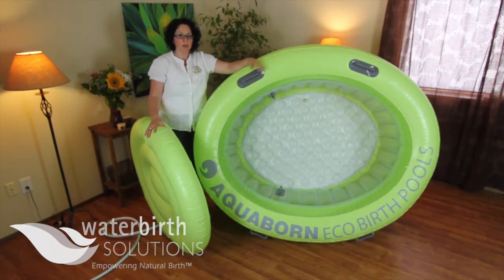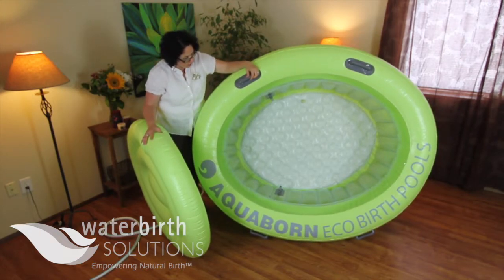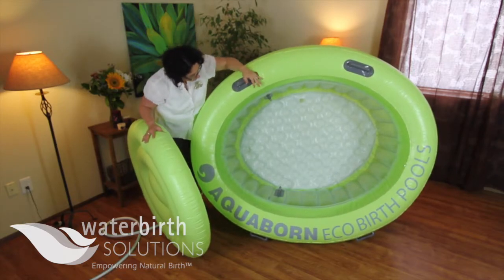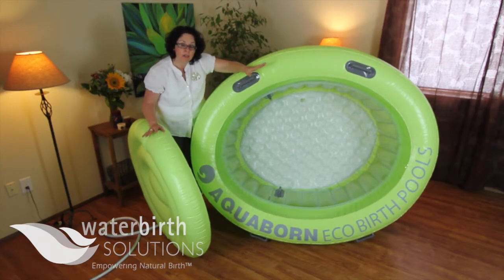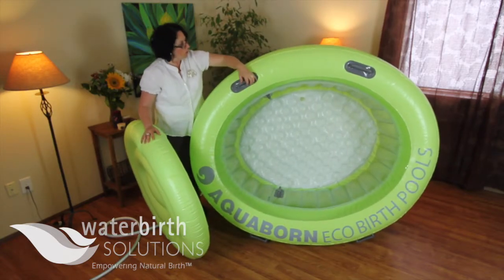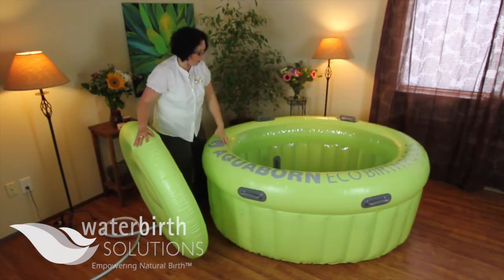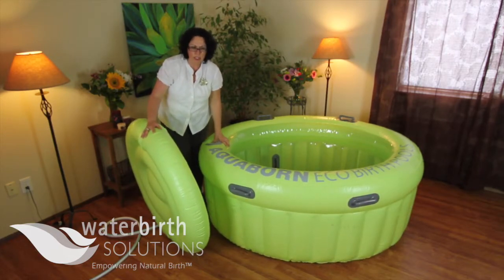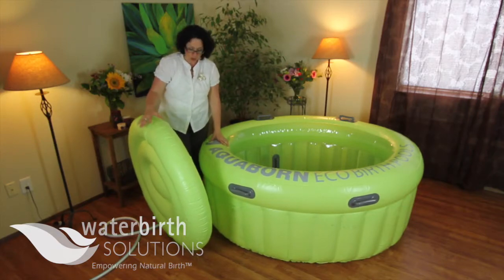Hi, this is Marla Althaus with Water Birth Solutions. I'm showing you a completely filled Aqua Born pool — we've inflated it and left it sit overnight. I wanted to mention that oftentimes the floor may not appear like it's full, however it is, and once you put water in there it's going to even out and be very cushy and comfortable. In the morning your pool should be very firm, roughly as firm as it was the night before. You can always top it off if needed, as cool air can sometimes cause a little shrinkage.